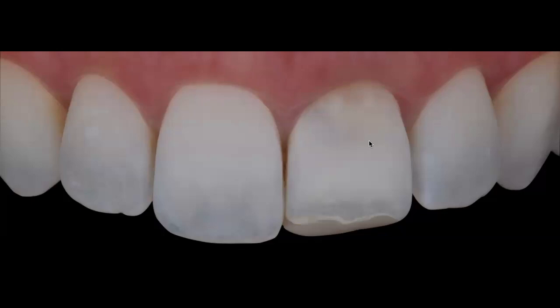The other thing is that I want you to look at the middle third of tooth number 9 and compare it with the middle third of tooth number 8. There, I barely have to do anything. So I can probably just get away with using whatever shade I choose for dentin, and I'm going to be able to layer in that area. The only area that I'm going to have to come back and layer, and look at the way I'm going to create that halo effect, is the incisal third.